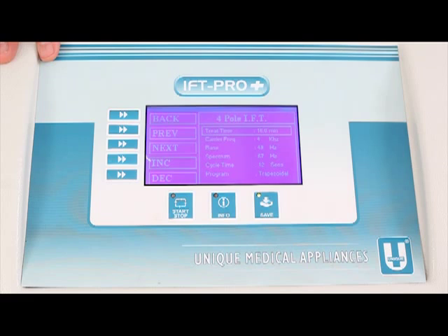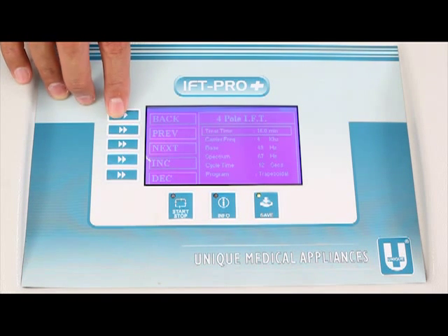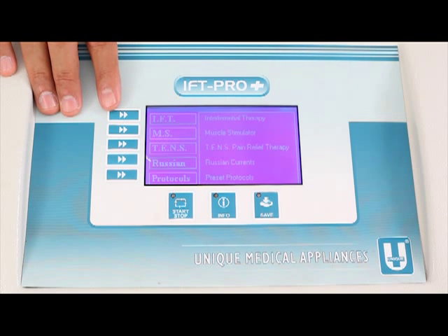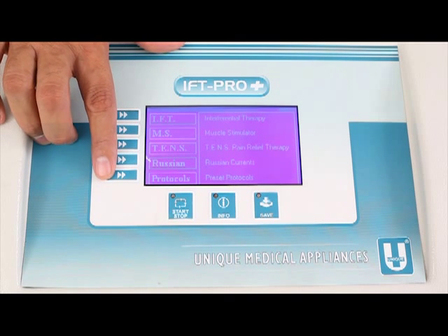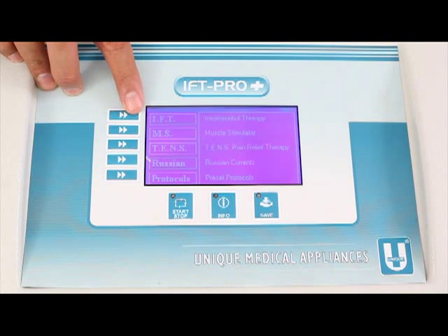After stopping, the machine returns to the Four Pole submenu and repeats all the parameters set before the session: Treatment time 16 minutes, Carrier frequency 4 kHz, Base 49 Hz, Spectrum 67 Hz, Cycle time 12 seconds, Program trapezoidal. Pressing F1 repeatedly navigates back through the IFT submenu to the main menu, which again announces all options F1 through F5. The same system applies to all menus — Muscle Stimulator, TENS, Russian, and Protocols. There are 25 empty protocol slots which can be programmed and reprogrammed for future use.